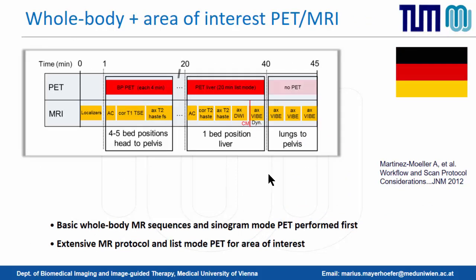Now, this is the kind of protocol that is used in most patients. As I mentioned in the beginning, most centers would focus on one region, use an extensive MR protocol there, and then use a basic set of MR sequences for the rest of the body.